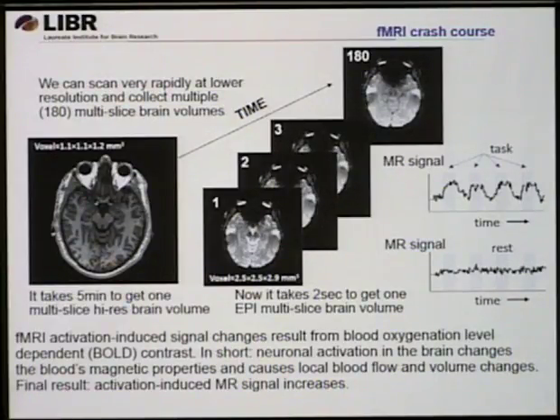So if I have a capability like this, I can simply repeat these measurements. In my first 2 seconds, I collect 40 slices like this, then in another 2 seconds, I collect another 40 slices like this, and so on and so on. So suddenly, what can I get from that? Here, I have 3-dimensional information, x, y, z, because I have many slices. But here, I also have 3-dimensional spatial information, plus information in time.